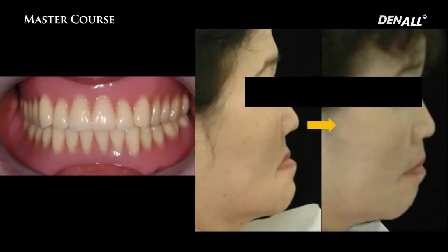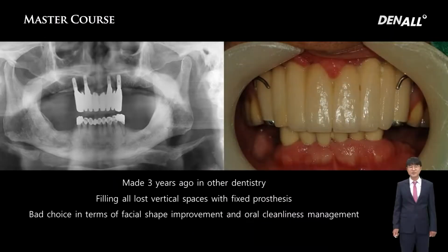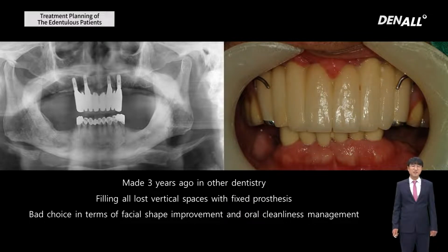The reason is because it is more favorable for profile improvement. This is a prosthesis delivered by a different dental clinic 3 years ago. You can see that fixed prostheses were provided, and in terms of horizontal profile improvement and oral hygiene management, it was not a good decision.